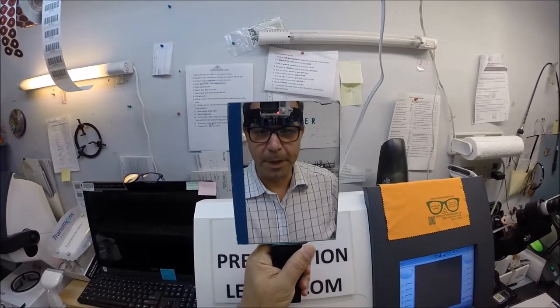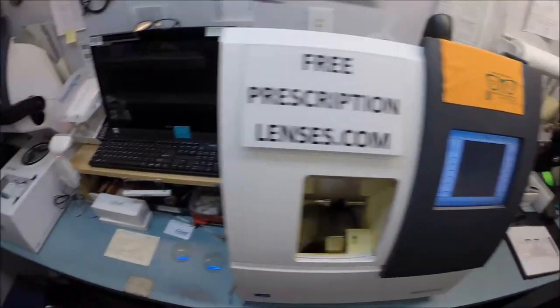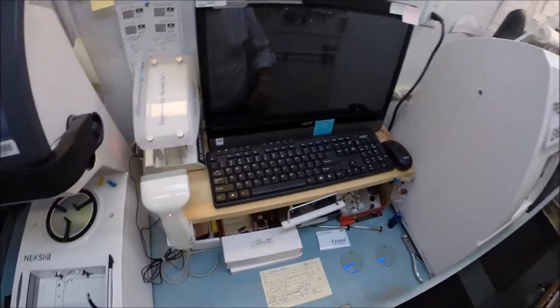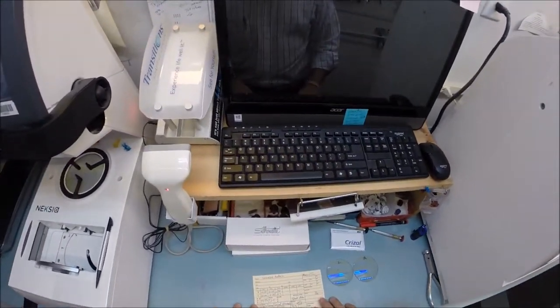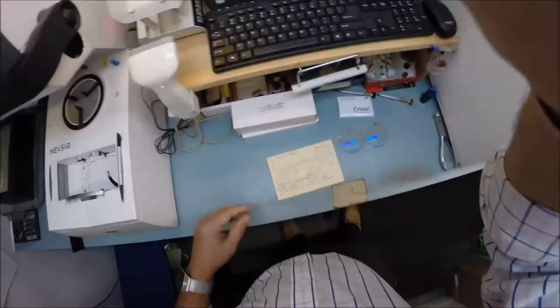Hello everyone, Seymour Better here at FreePrescriptionLenses.com. Today I get the pleasure of cutting my own lenses. I'm normally cutting lenses for everyone else and too busy to do my own. Today let's do that.